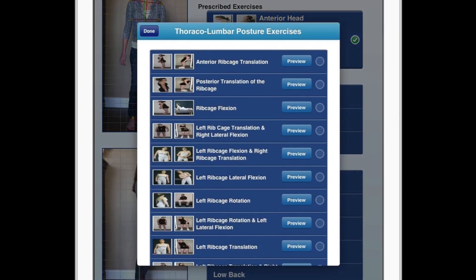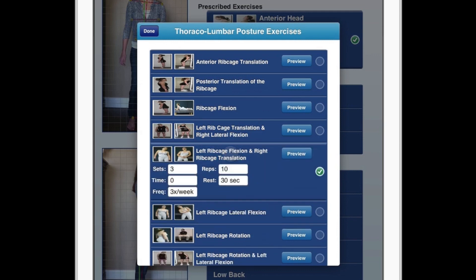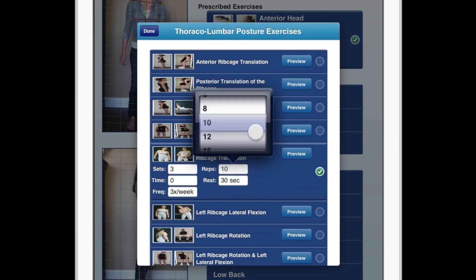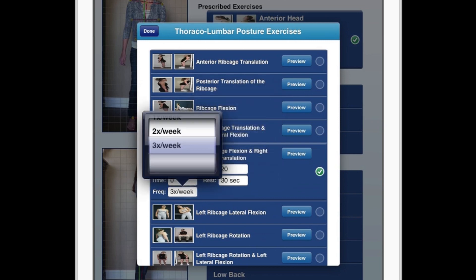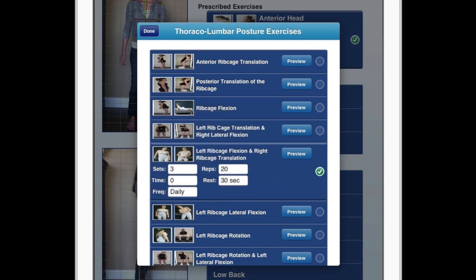Next, let's do her thoracic AP posture. I can see that she has a right high shoulder or ribcage just slightly to the right. Looking here, there's the left ribcage flexion and right ribcage translation. If I want to change the sets and reps, I can do so here as well, and I want to make that a daily occurrence.